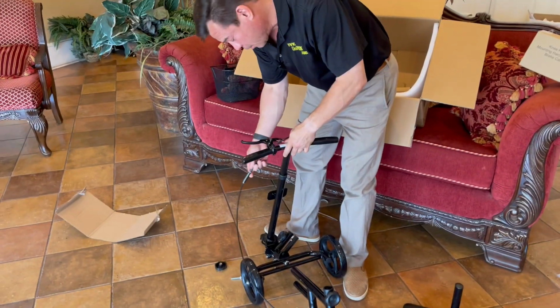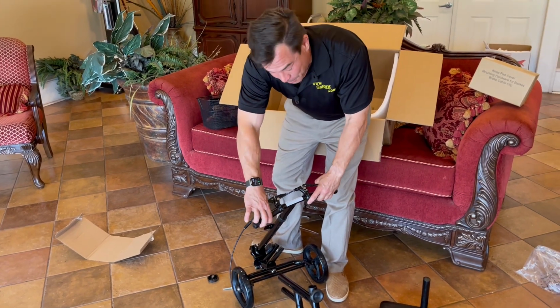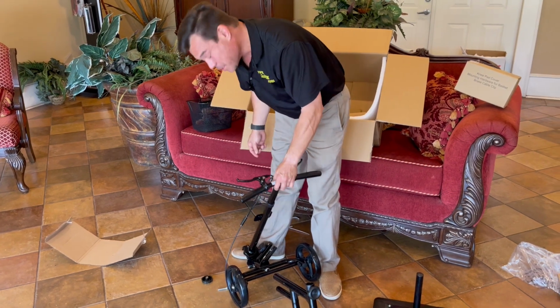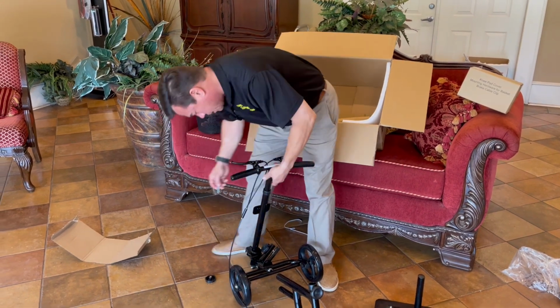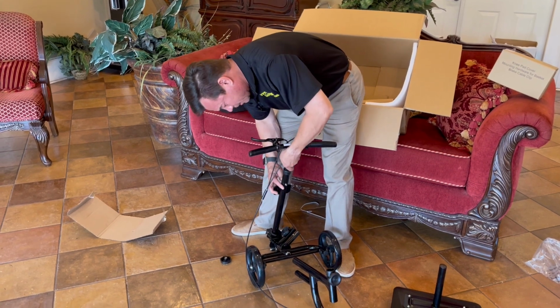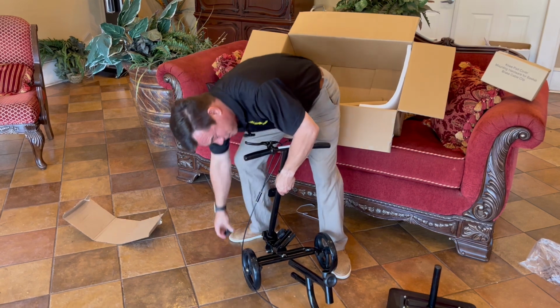Keep this cable out of the way, and one thing is you always make sure that the brake bars are on the front. I'm going to be quite honest, I've put a couple of these together where I haven't been paying attention, and due to my genius skills, I put the handlebars on backwards. So it happens, even to the best of us, or the worst of us.